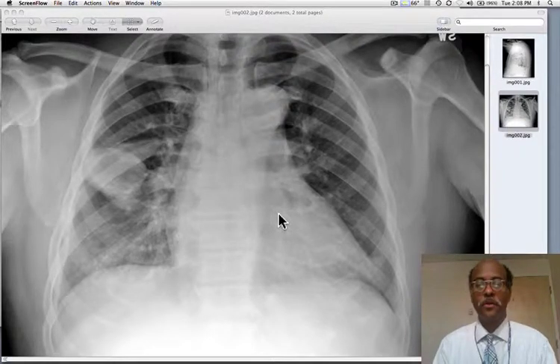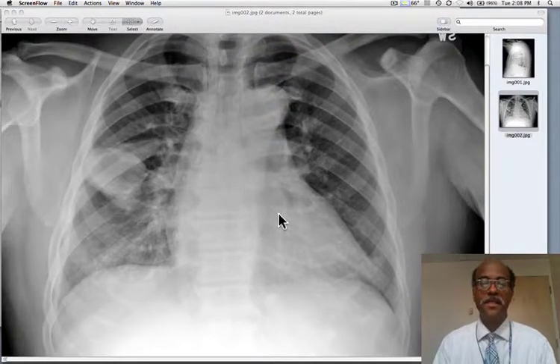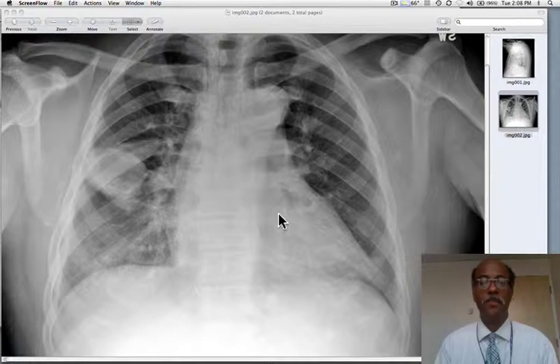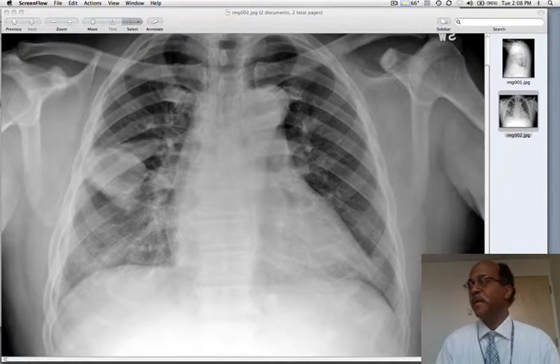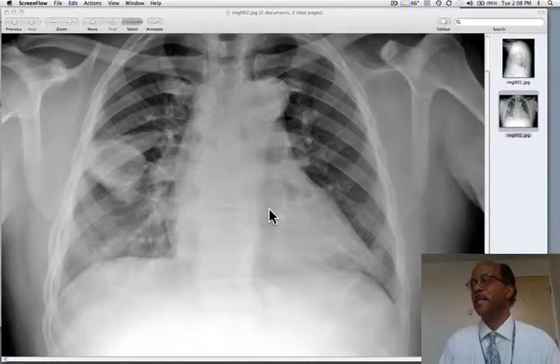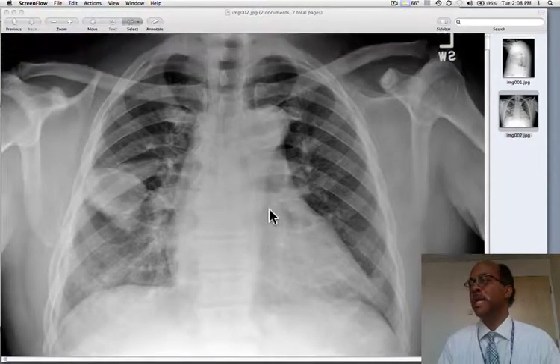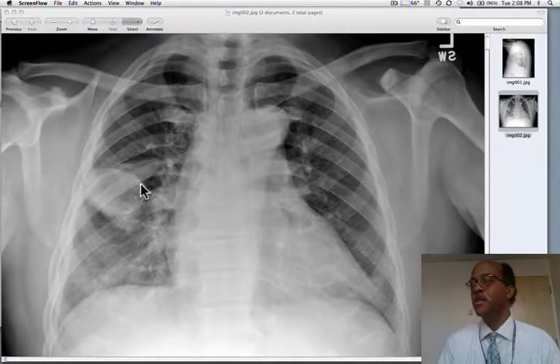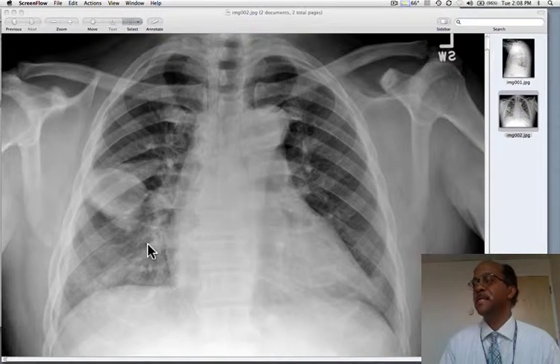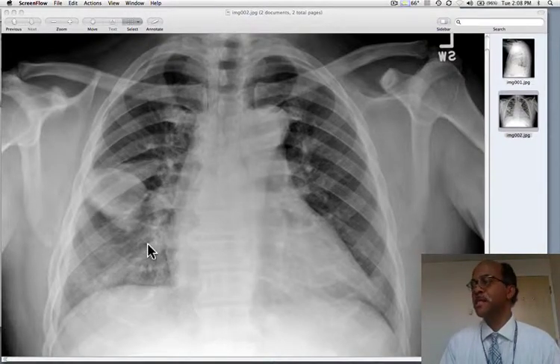Today I'm going to show you a case of a pleural abnormality that mimics a lung parenchymal mass. Here we have a patient with a chest x-ray that shows a large, smoothly shaped mass that's sitting in the area of the right mid-chest.